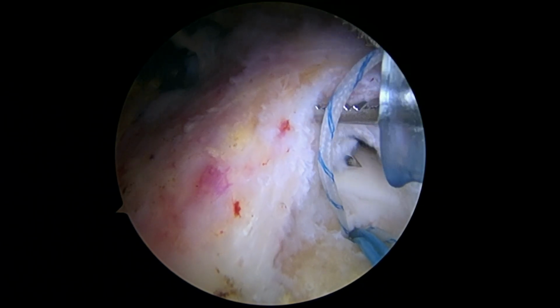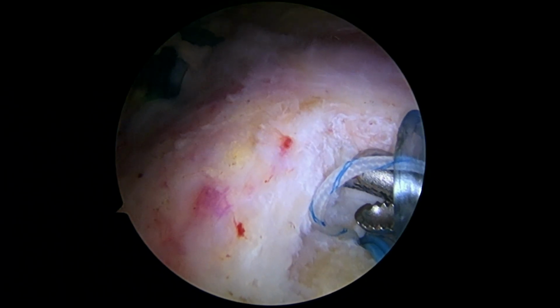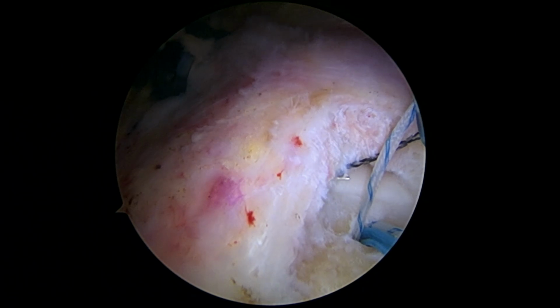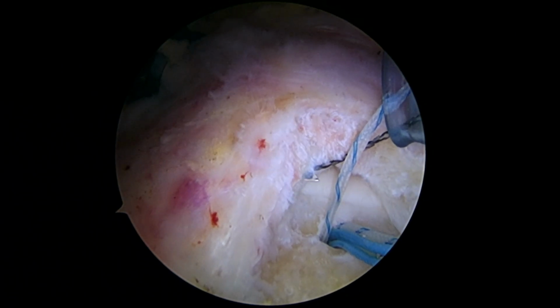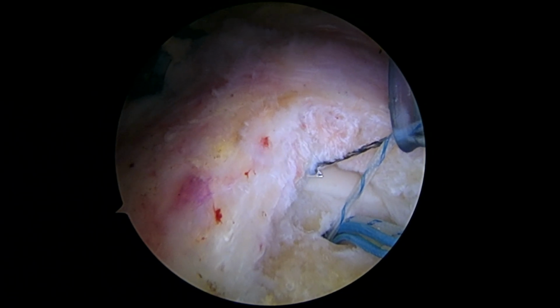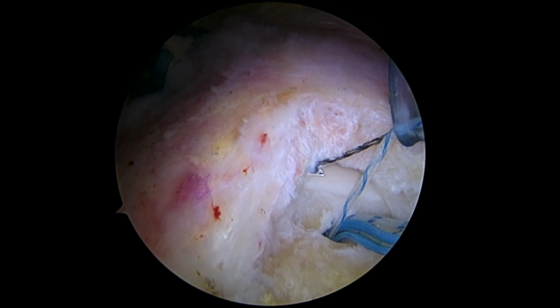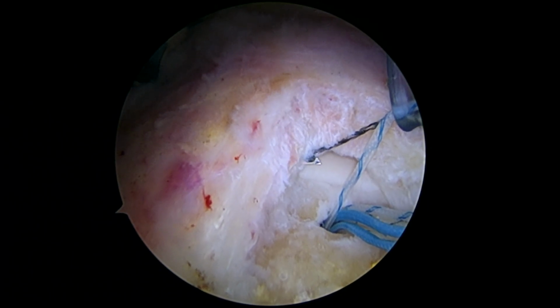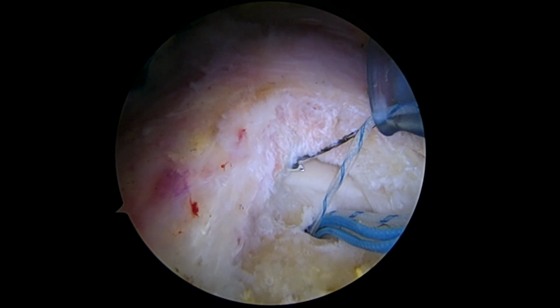And there you can see I get all the way underneath. I'm going to feed that black wire. The reason we use that relay is because we can't pass the suture by itself, and that relay has a bunch of holes in it that we can use to capture the suture. And then it does just like it's named. It relays the suture back. We'll show you one time here so you'll have an idea of how that looks.